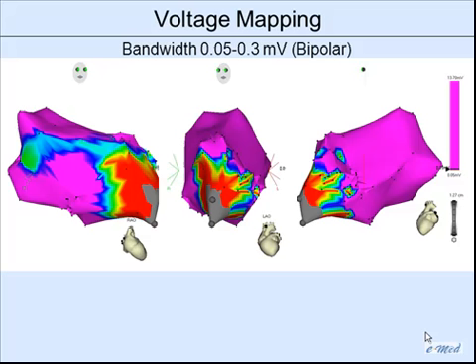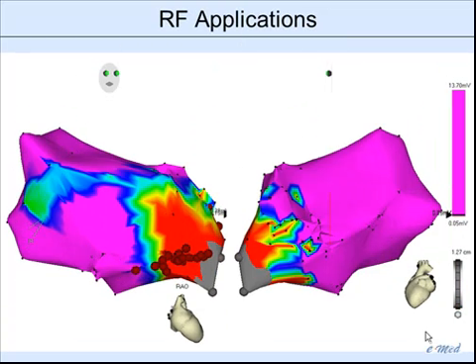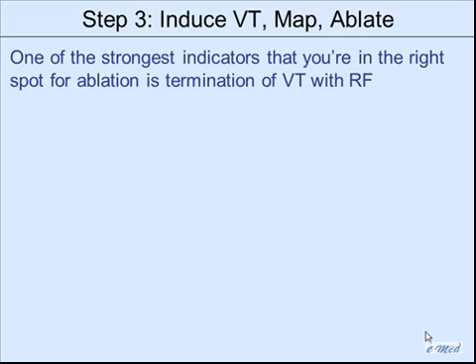And slicing it even thinner, some of the Spanish investigators have looked at this. And you end up with something that looks like this, where there's really a potential channel running through here that, if you didn't have good mapping information from that area, you may still want to close that off if possible. And a couple of other areas up here as well to try to eliminate conduction through there. And then conducting through this from dense scar to more normal myocardium. That's one strategy there.